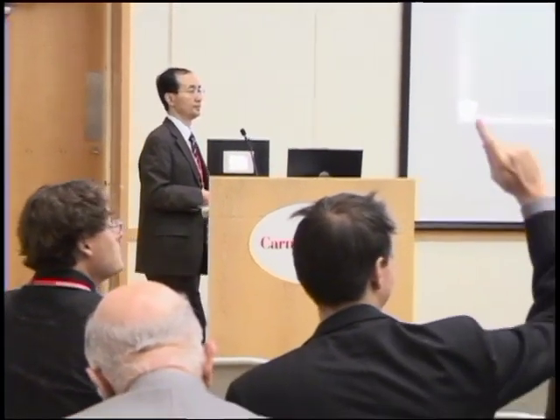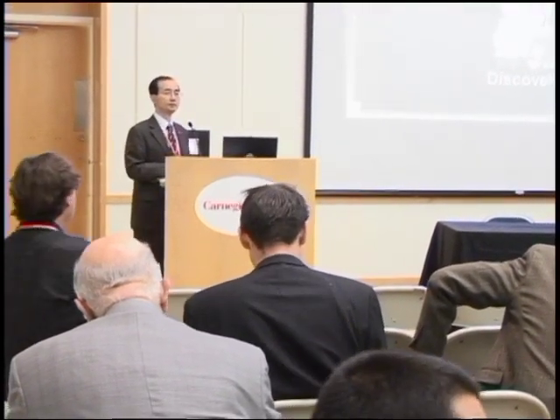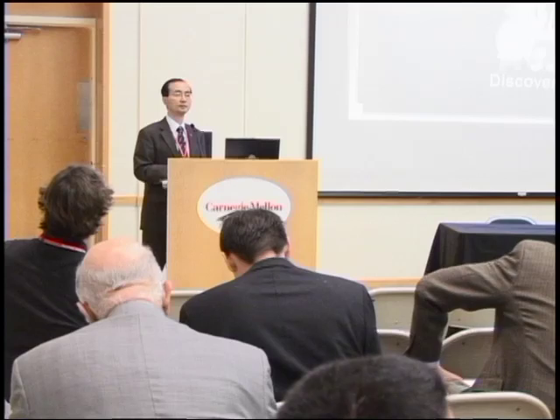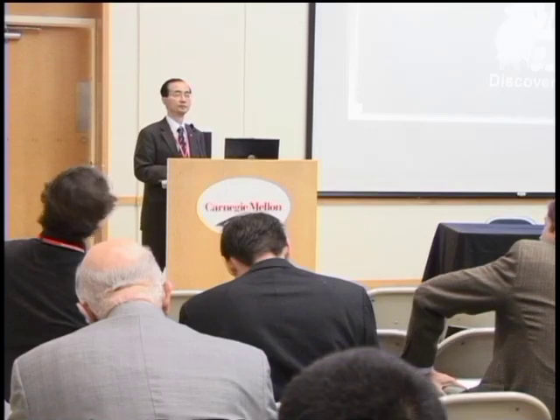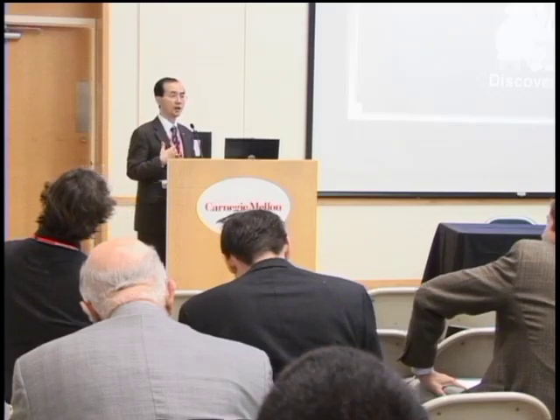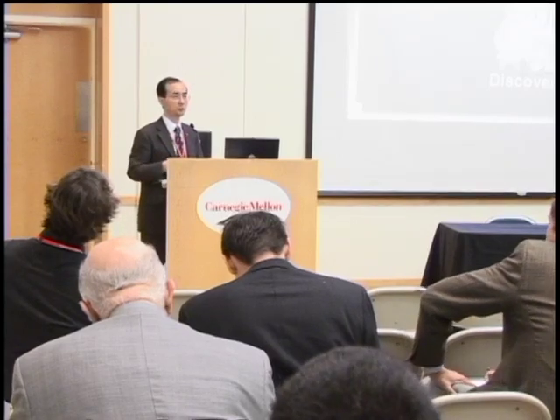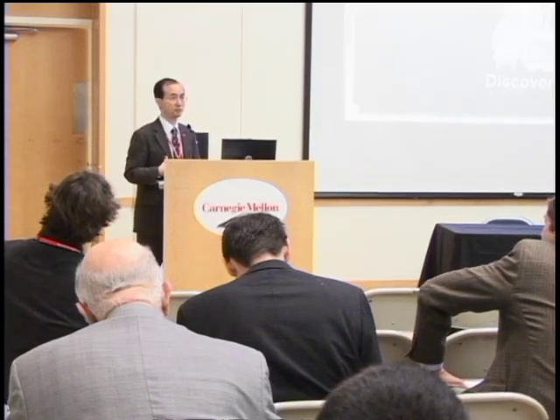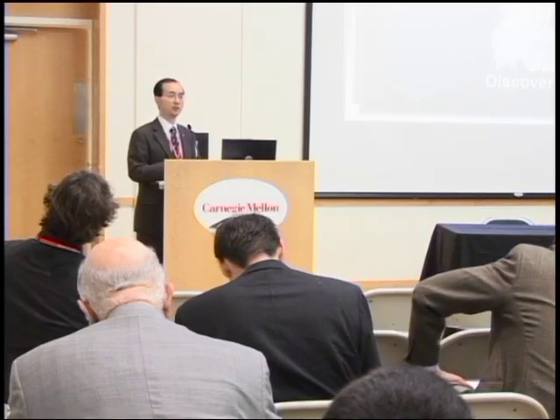Time for one question, George. Well, I was wondering what the trade-off is with aperture size. If you made a much bigger aperture somehow, or multiple apertures simultaneously, that might reduce the speed requirement. If you have multiple apertures for hospital use, it's not convenient. First, the technician has to operate the two transducers, and also there is limitation by the human anatomy because you have bone restriction. Some places are opaque to ultrasound.